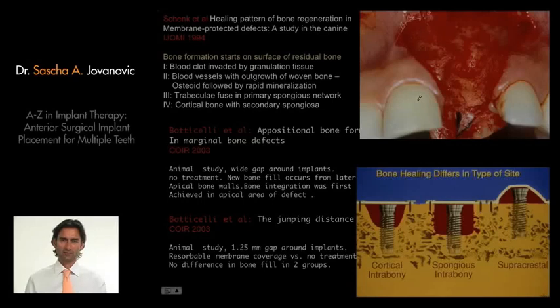And for that purpose, I use bone regeneration. I use the concept of membranes protecting the site, separating the bone graft from the flap, from the bacteria, and I use the concept of guided tissue regeneration. New treatment options are emerging, and specifically looking at growth factors. But today we still use very much the treatment of guided tissue regeneration.